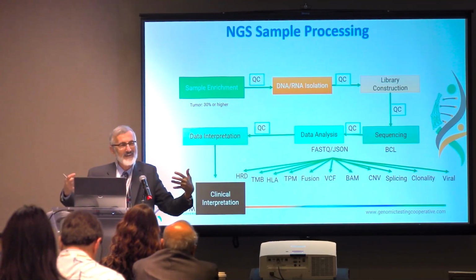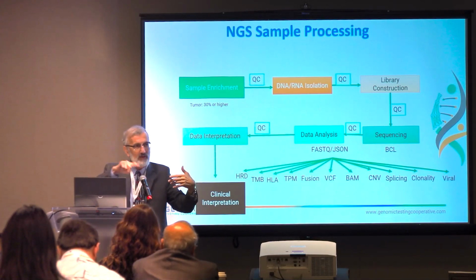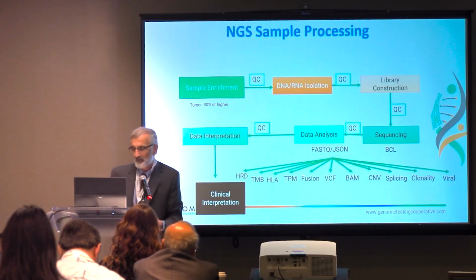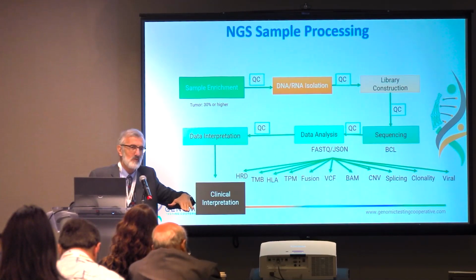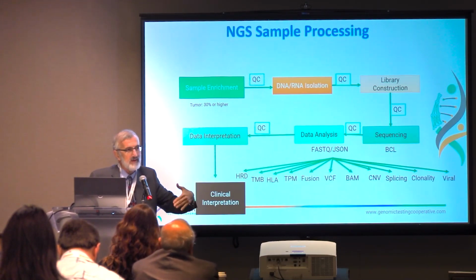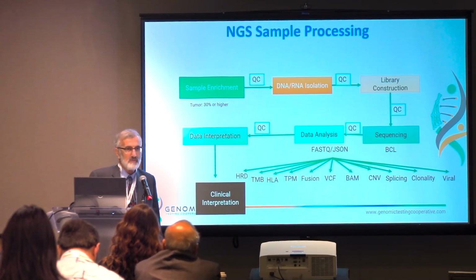But we don't call them a translocation when it is alternative splicing, if they are close to each other. This is why it is very important to have a list of the hot translocations that we look for. It makes it much easier for the pathologists and for the technologists to pull them out, and our software will pull them out completely as separate and give us the option.